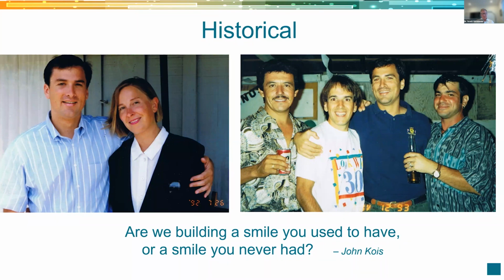So I've learned from John to ask the question, are we building you a smile that you used to have, or is this a smile you never had? And certainly if it's a smile they used to have, you better have them bring a picture in, or they're going to bring it in right when you're getting ready to deliver the case, and that's already too late.